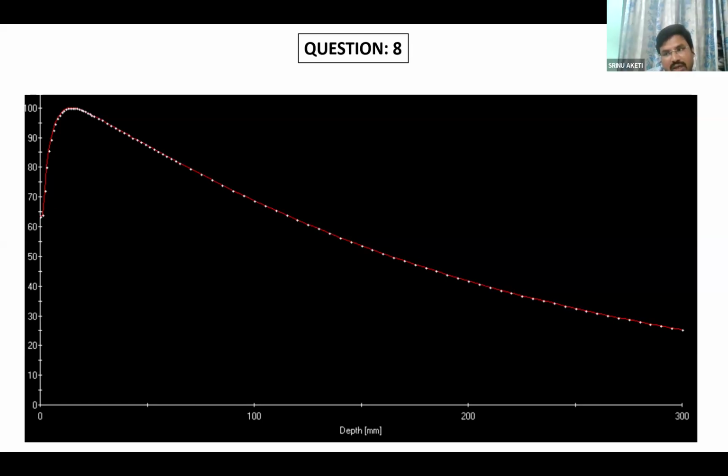So as I said previously for profiles, a profile is the dose variation across the beam. Am I right? Yes, sir. Now this PDD is the dose variation along the central axis of the beam with respect to Dmax. That's all. In layman language, this graph indicates how your dose varies as you are traveling from one depth to another depth along the central axis. Yes, sir.